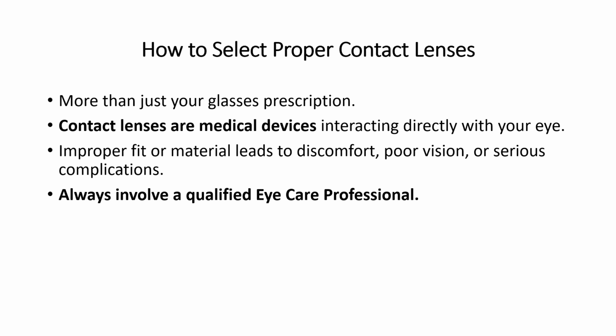Moving beyond risks, let's talk about how to properly select contact lenses. This is a crucial decision that goes far beyond simply knowing your eyeglasses prescription. Remember, contact lenses are medical devices that interact directly with the delicate surface of your eye. An improper fit or the wrong material can lead to discomfort, poor vision, or even serious eye health complications. Therefore, the selection process should always involve a qualified eye care professional, whether that's an optometrist or an ophthalmologist. This isn't something you should ever attempt on your own.